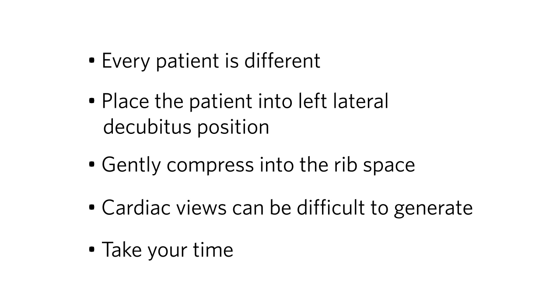Exercise caution when using ultrasound for cardiac assessment. Obtaining and interpreting cardiac images is one of the most difficult point-of-care skills. Obtaining a good quality image is challenging. Give yourself plenty of time to practice this skill before incorporating cardiac scanning into your clinical practice.